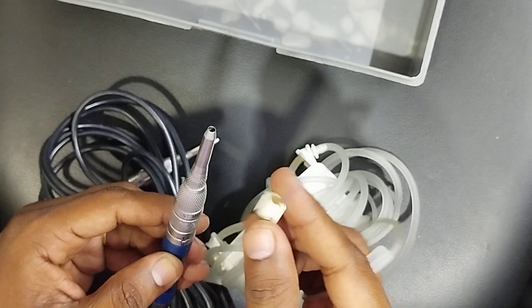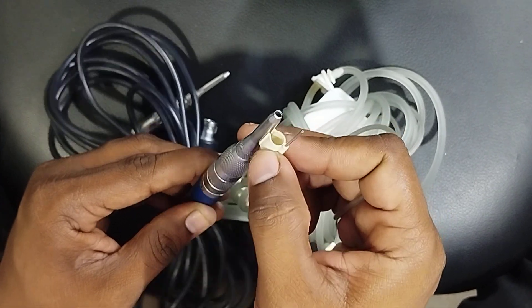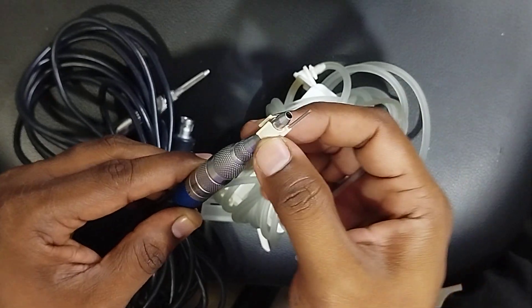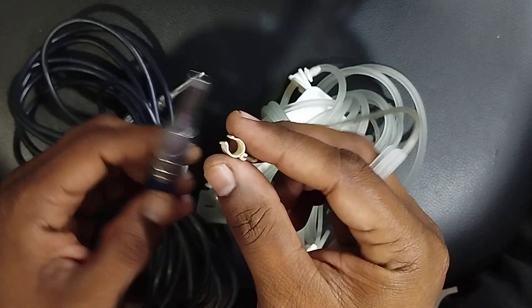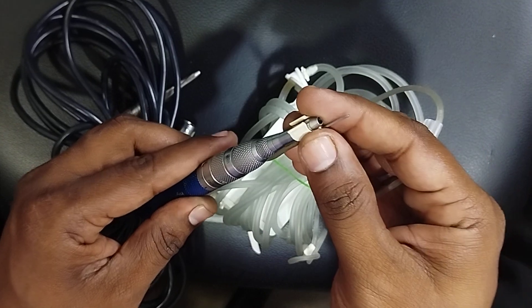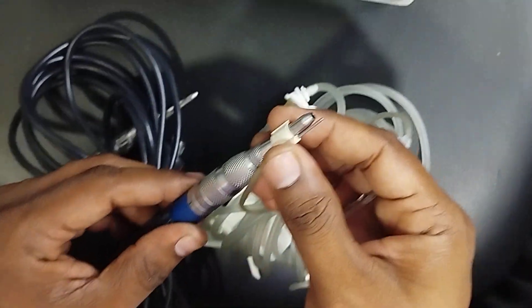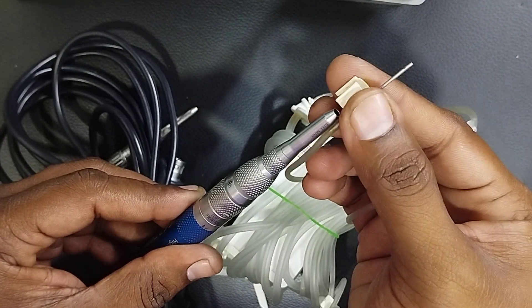Whenever you try to put in this irrigation tube, many people make a mistake — they press it like this. You are not supposed to do it that way. Always put it like this; this is the proper method. Otherwise, when you press incorrectly, the adapter may get broken. Our recommended method is this same proper process — go up, then come back.